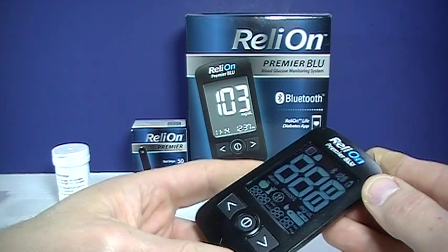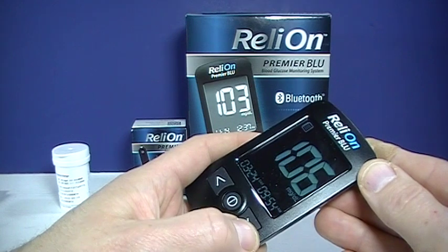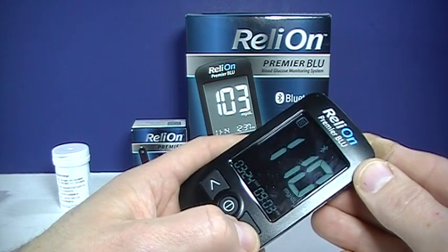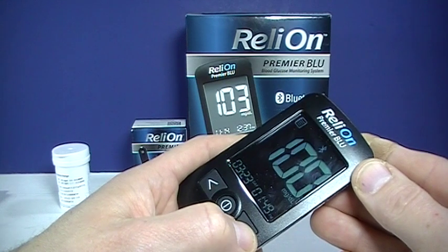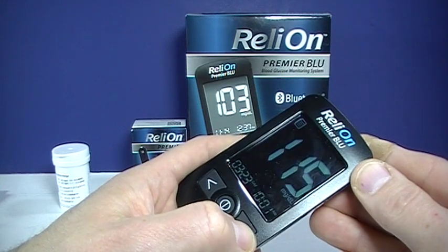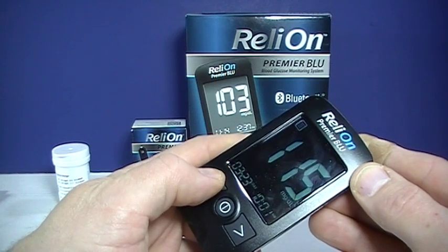Now if you turn it on, you can go through your historic readings. You could also go through some of your averages. It'll show all the different readings that you've taken recently and how you coded them.